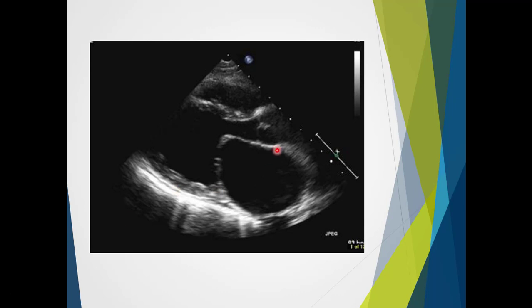Here in our parasternal long axis window, we've got our left ventricle and we can see the anterior leaflet and the posterior leaflets clearly.